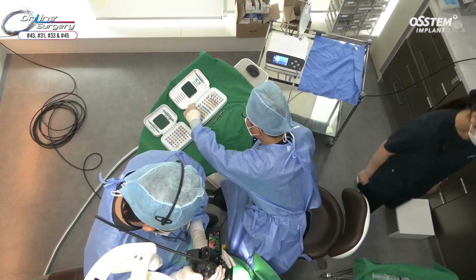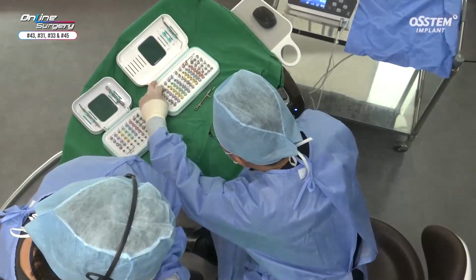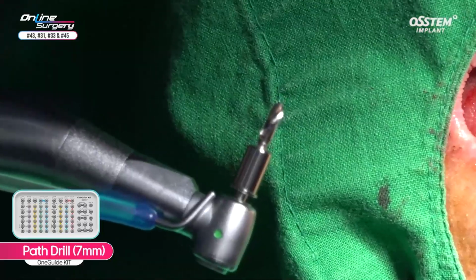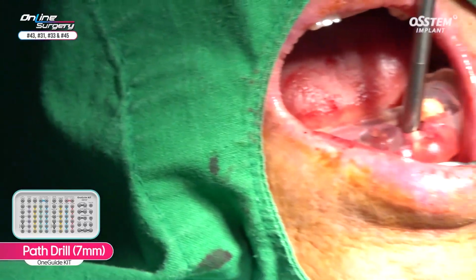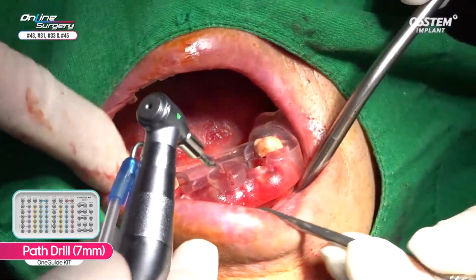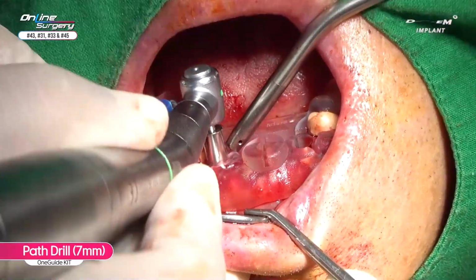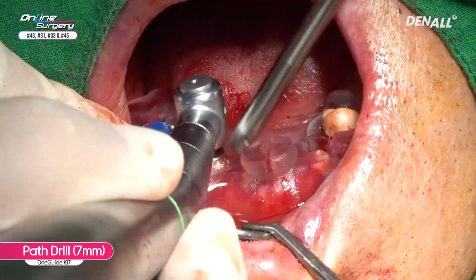Because here it's a canine area, path drill will be used. For path drill, we need to start with shorter one. This is 7 millimeter drill. Because it's extraction socket, it's not going to come in contact, probably.